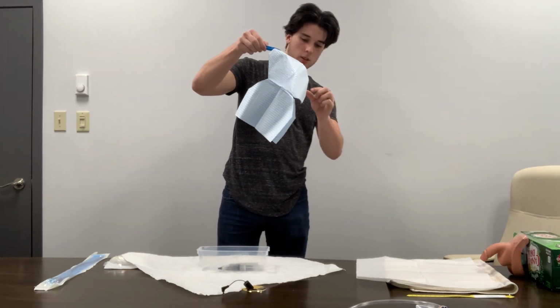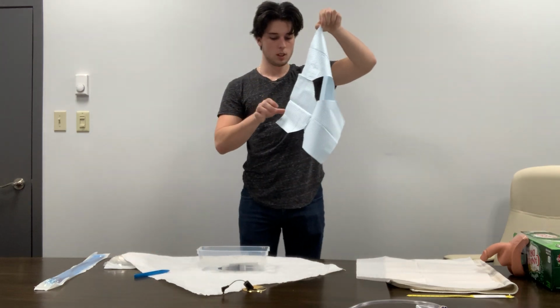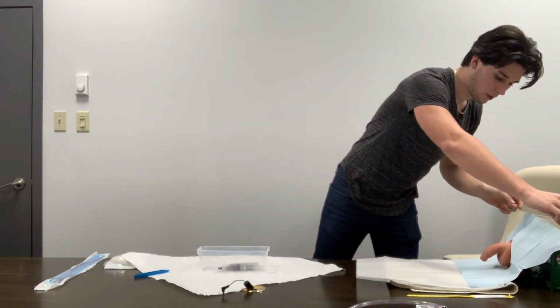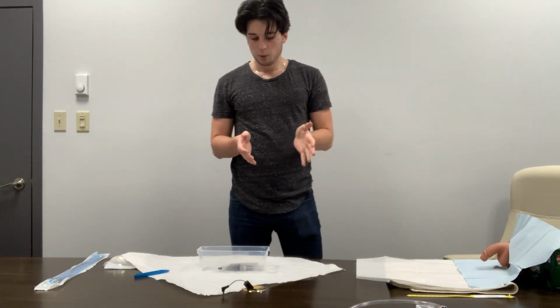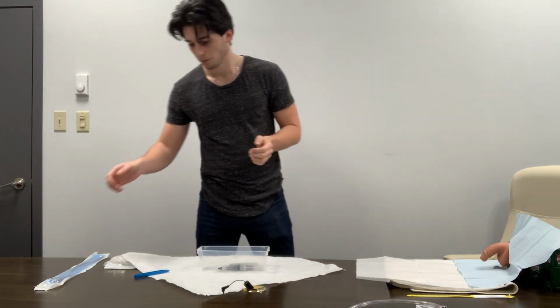and as well grab the corners of this drape too. And once we have grabbed the corners of this drape, we will insert it just over the penile area of the patient, so their genitalia is exposed and we can work with it. And then once that is placed, we can go ahead and grab our catheter.